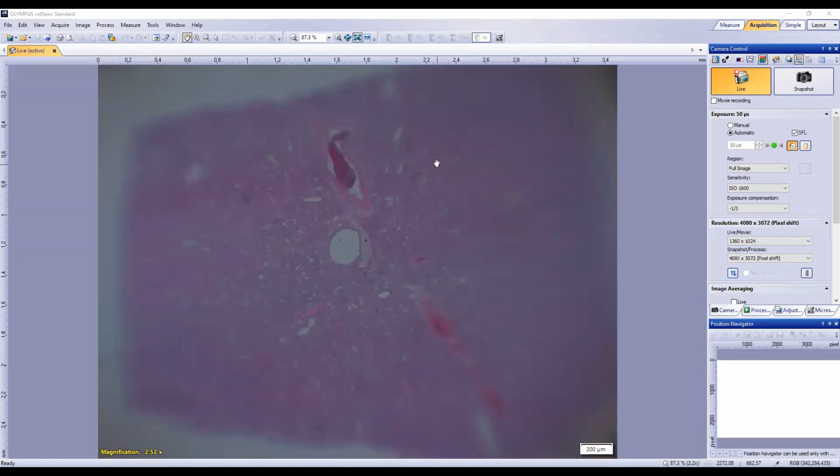Yeah, sure. So talk us through what you're thinking is behind the pneumonia. Because I thought more bronchointerstitial than just interstitial. I don't see many open airways at all. You've got that big bronchus in the middle, but the rest is quite dense. So I think it's not only the alveolar walls being affected, but also something going on within the spaces that is totally occluding them with cells. Or whatever, probably cells.